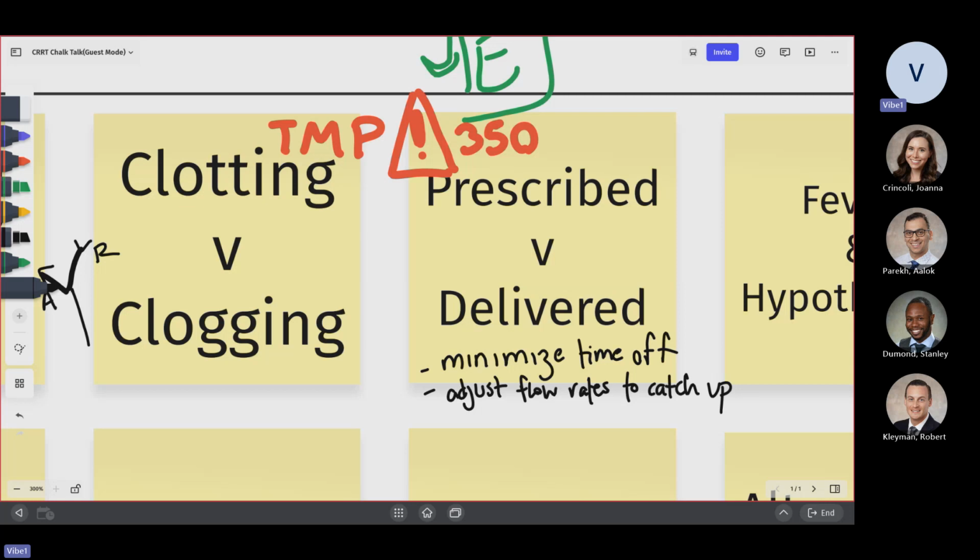And then I'll do it for a couple of hours. If I feel like I need to continue it, I'll let the nephrologist know. If I feel like it was just a temporary thing that I had to do, and I do their VExUS scan again and it goes from a 3 to a 1, then I can go back to what the original prescribed dose was.